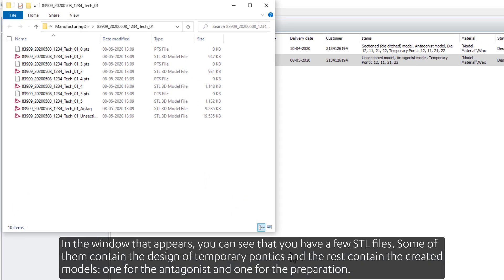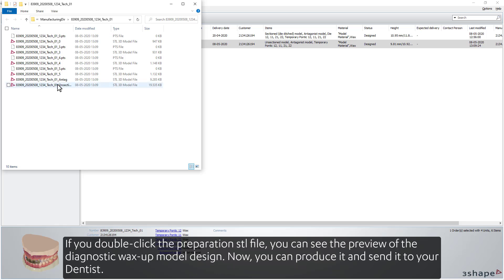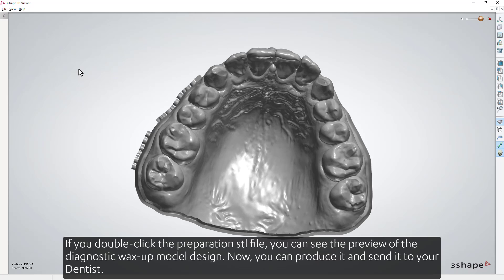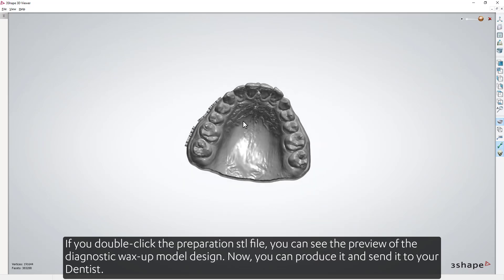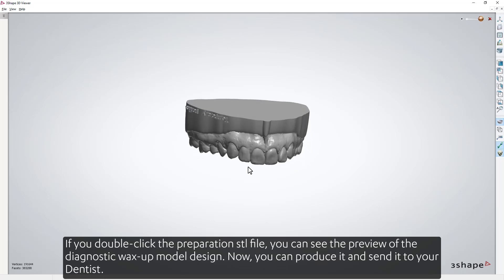In the window that appears, you can see that you have a few STL files. Some of them contain the design of temporary pontics, and the rest contain the created models — one for the antagonist and one for the preparation. If you double-click the preparation STL file, you can see the preview of the diagnostic wax-up model design. Now you can produce it and send it to your dentist.